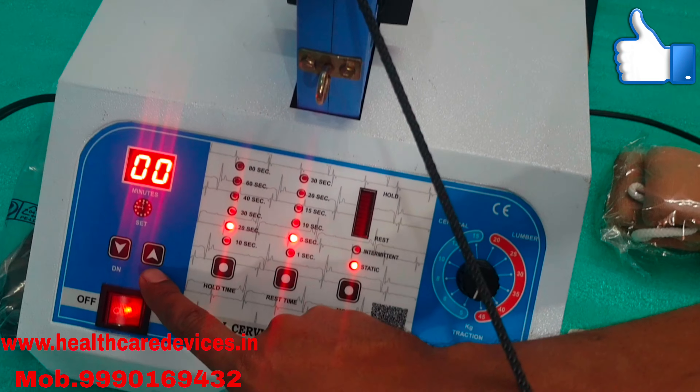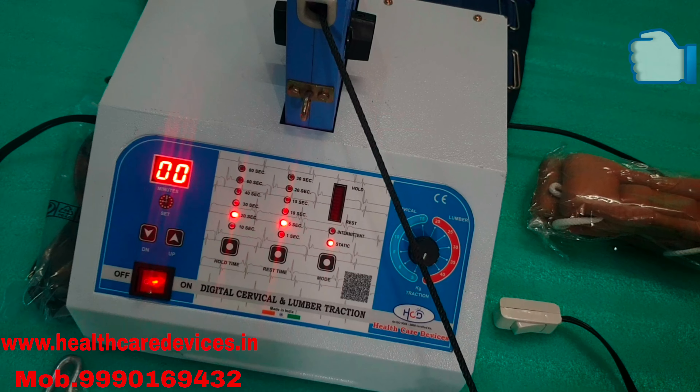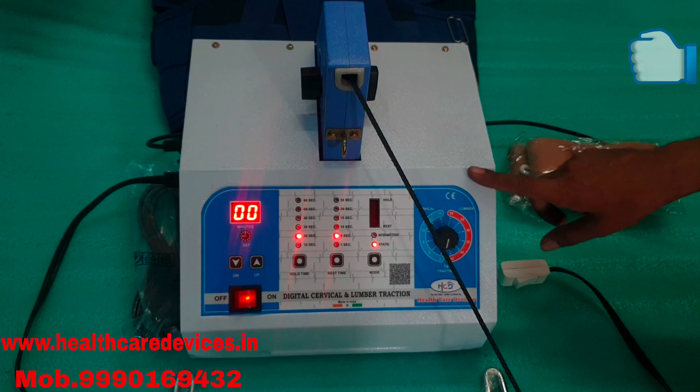I will add the timer. We will start the timer and the machine will be on.